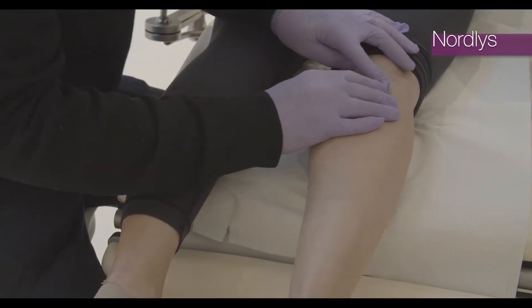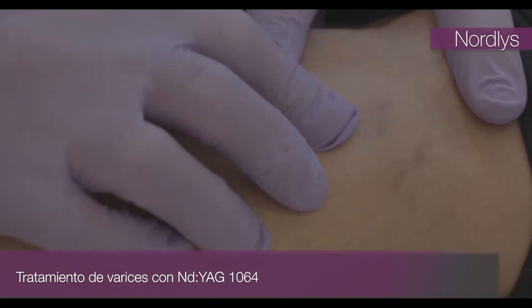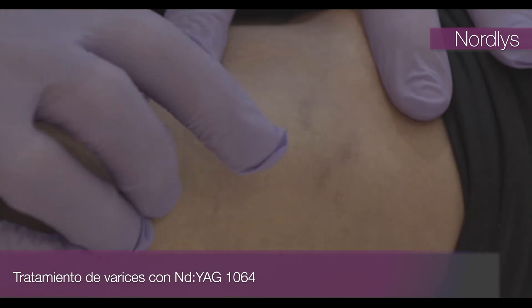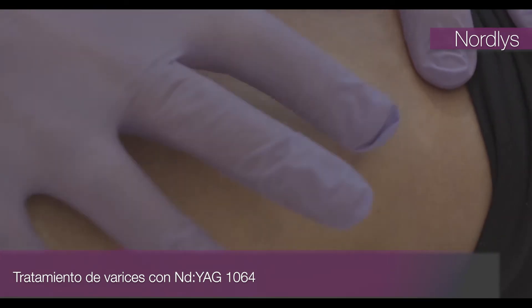We're going to treat leg veins and we've got some nice ones here. You can see when I push them I can squeeze them so they disappear, but they fill up pretty fast.